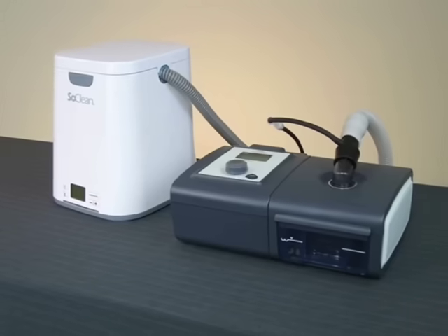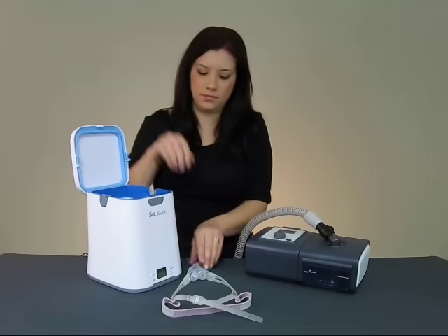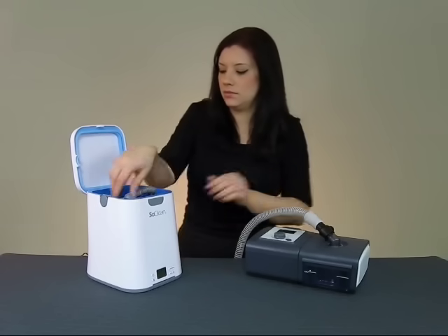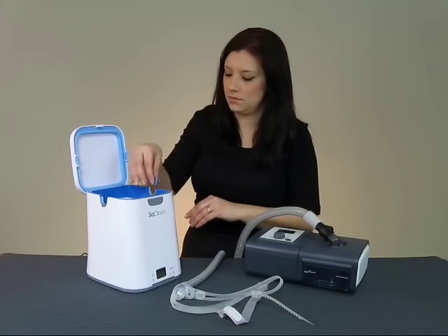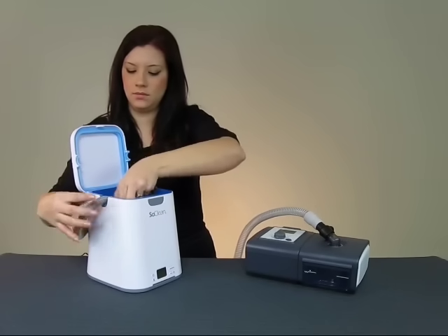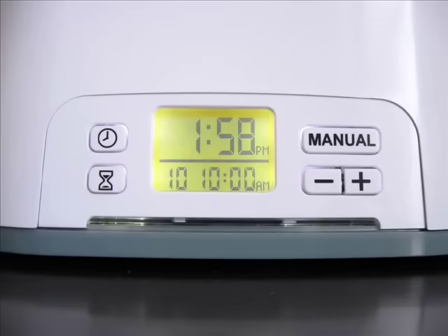After the initial setup, using your SoClean is extremely easy. Begin by opening the lid and placing your mask into the chamber, allowing its attached hose to rest in the open hose slot. The SoClean gives you the option of inserting your mask and hose from either side of the machine. To change sides, remove the hose slot plug by lifting it straight out and inserting it into the slot on the opposite side. With your mask and hose in position, close the lid firmly, allowing it to snap shut. The SoClean will now operate according to its preset time and duration.